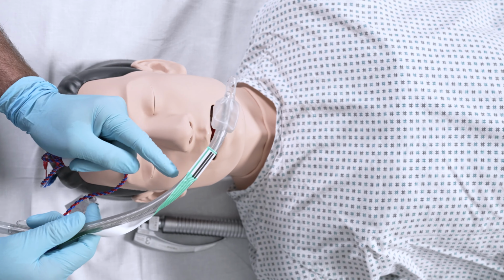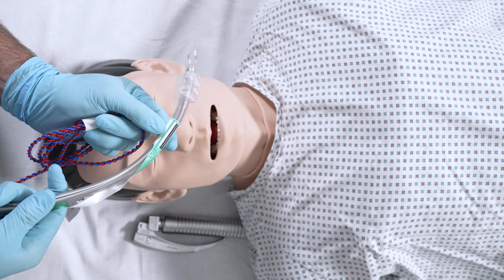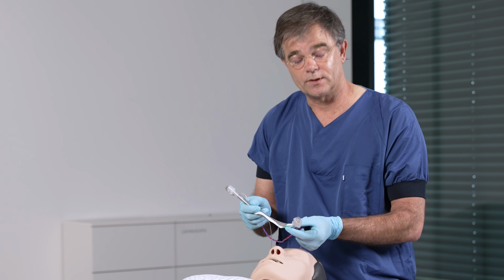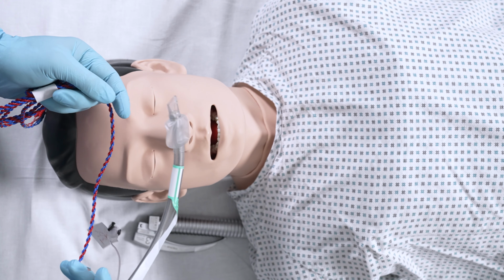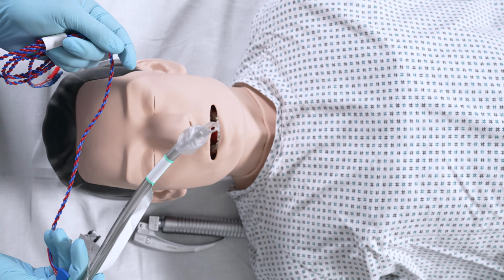This is a tube with electrodes on it, and we use this special tube during thyroid surgery. The surgeon can see during surgery if the vocal cords are still working and if there's no damage to the recurrent laryngeal nerve. This can be placed with normal direct laryngoscopy, as we have done for years. So I've got a Macintosh blade, the direct laryngoscope, and I will show you how it is done.